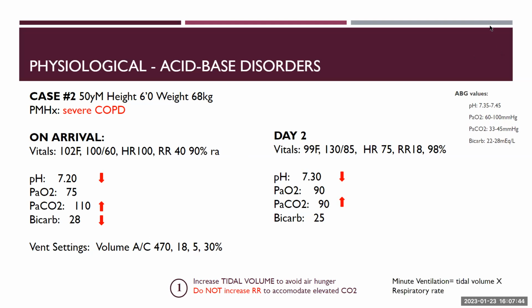And then I just wanted to highlight again this equation of understanding minute ventilation, so tidal volume times respiratory rate. So really keep this in mind as you're making vent changes, that it's not just a respiratory rate or a tidal volume, but really keeping in mind the minute ventilation equation.